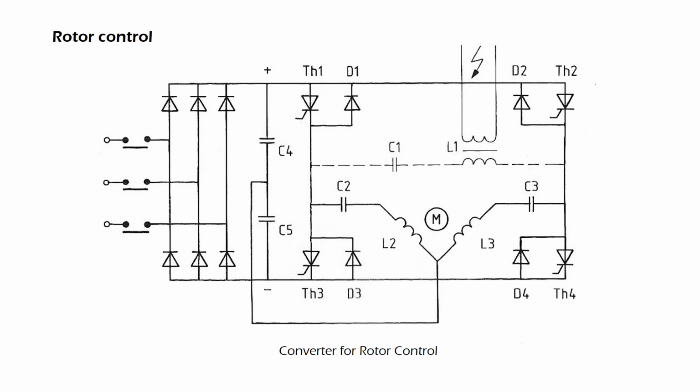In this way, the thyristors TH1 through TH4 and the diodes D1 through D4 are used for two purposes. On one hand, to start anode rotation and, on the other, to generate the high tension for radiography and fluoroscopy. However, many other high-frequency X-ray machines use a separate and dedicated converter for rotor control. The principle of operation described here remains the same, excepting the switchover of the contactor.